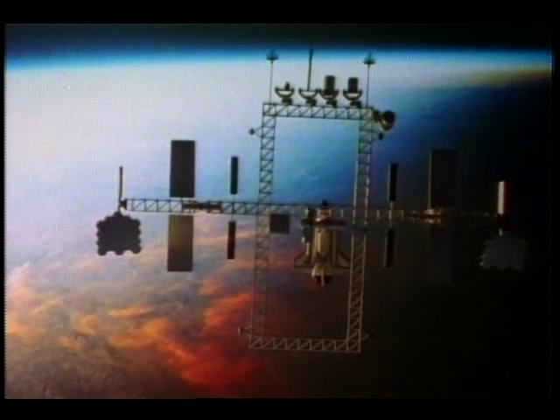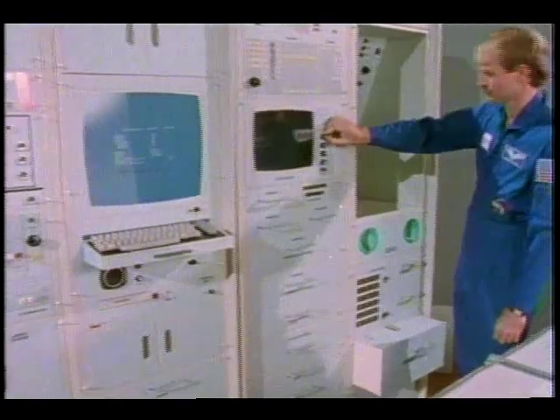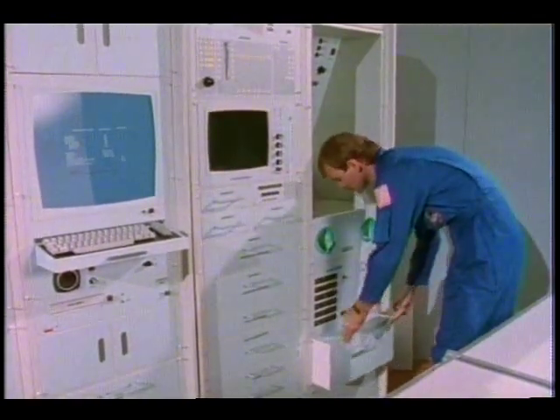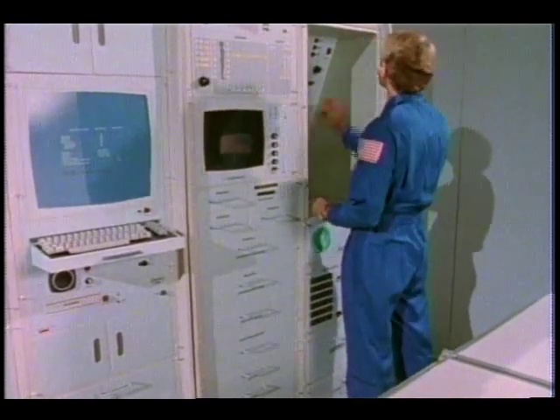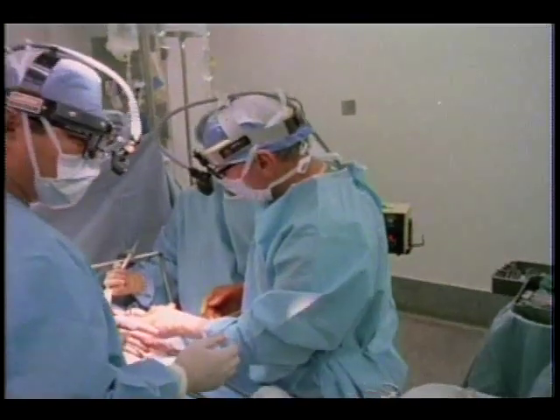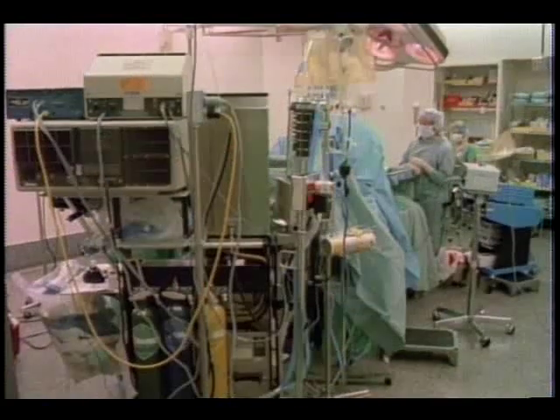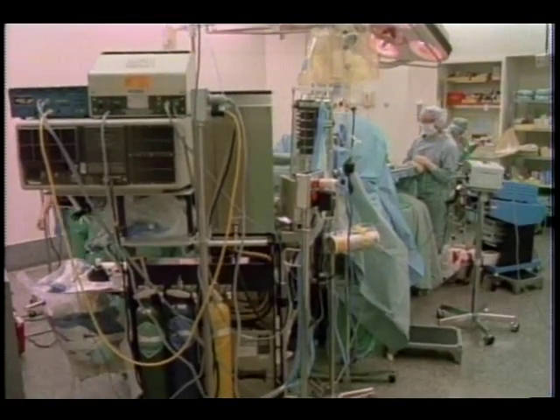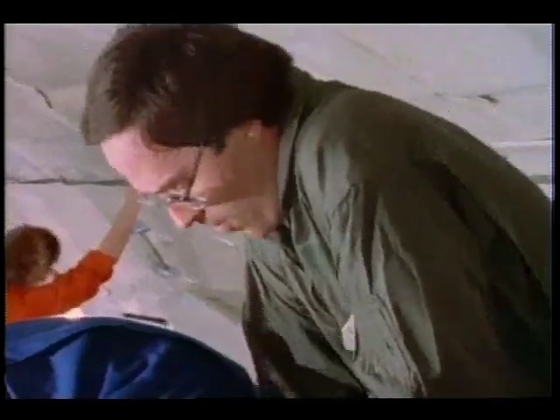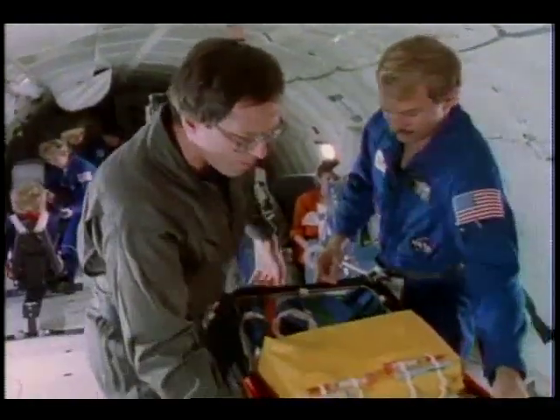Although each of these capabilities will be needed on the space station, it isn't feasible to launch a large hospital facility into orbit. As a result, the entire health maintenance facility, with its preventive, diagnostic, and therapeutic capabilities, must be designed to fit into a very limited space. In a hospital, a large staff of highly trained professionals provides healthcare services. The space station will not have those resources. Because of limited medical personnel, the HMF equipment will be user-friendly and easily maintained. Equipment goes with the patient.